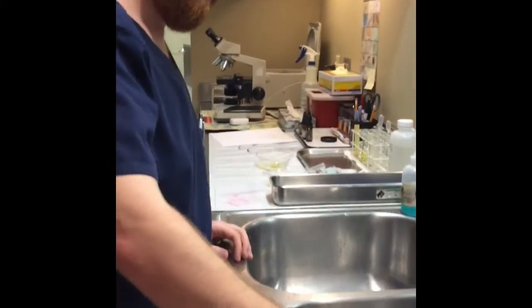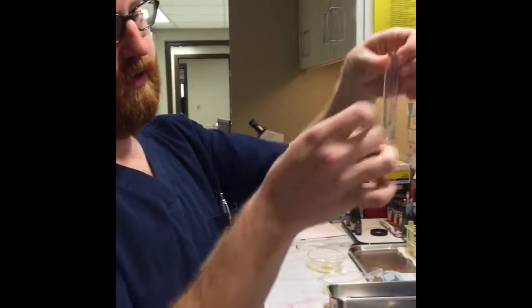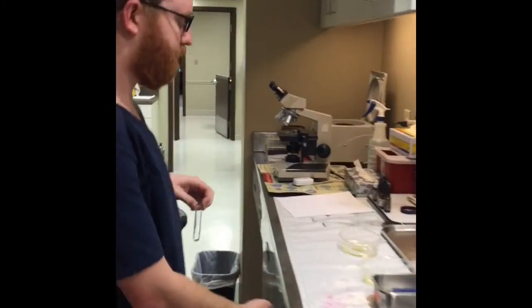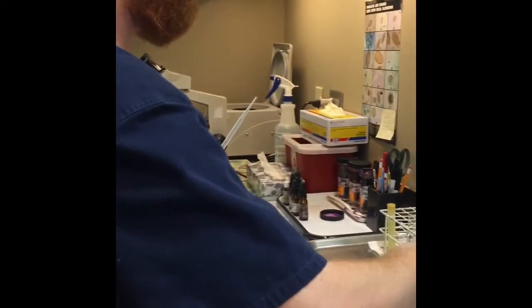So I'm gonna dump all the excess out, leaving just a little bit down here. I can actually get rid of a little more. And I'm just gonna kind of stir it up. That way, when I get my pipette, it's all in this little bit of liquid here. So I'm gonna get a clean pipette and a clean slide.